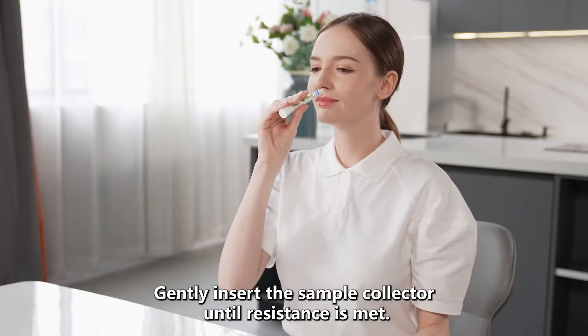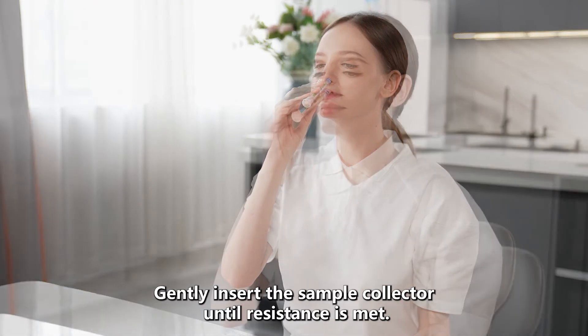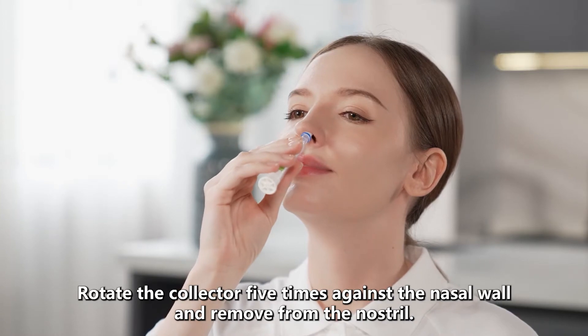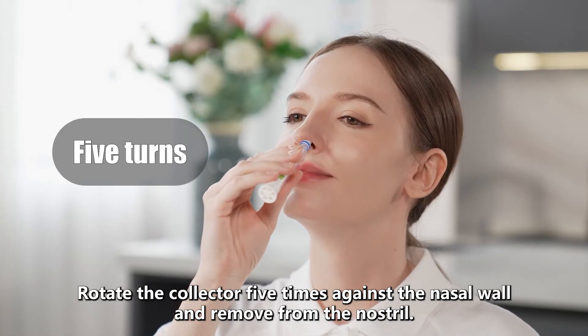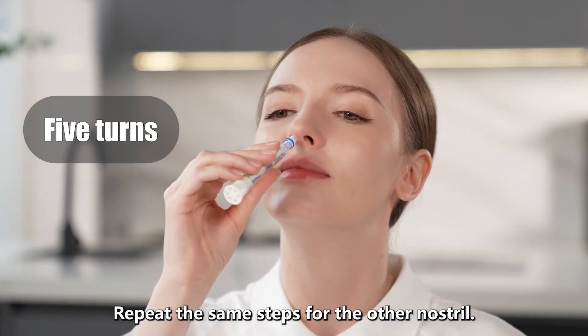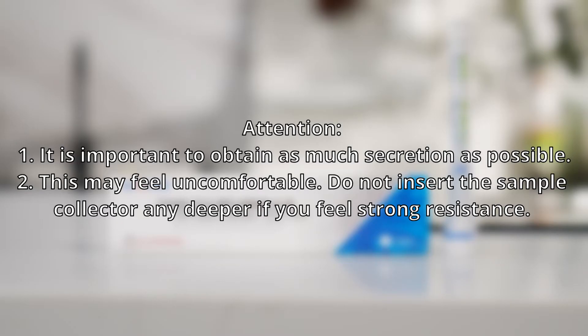Gently insert the sample collector until resistance is met, about 1 to 2 cm into the nostril. Rotate the sample collector five times against the nasal wall and remove from the nostril. Repeat the same steps for the other nostril. It is important to obtain as much secretion as possible. This may feel uncomfortable. Do not insert the sample collector any deeper if you feel strong resistance.